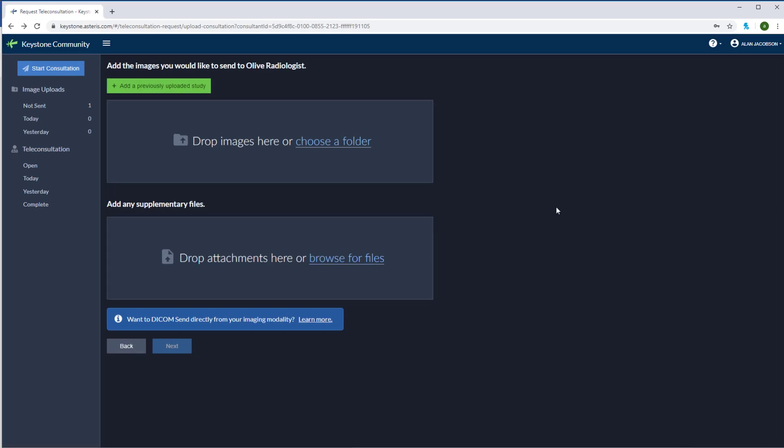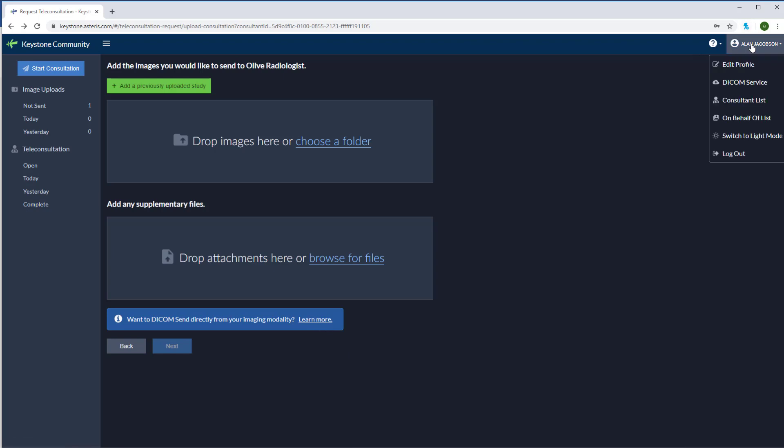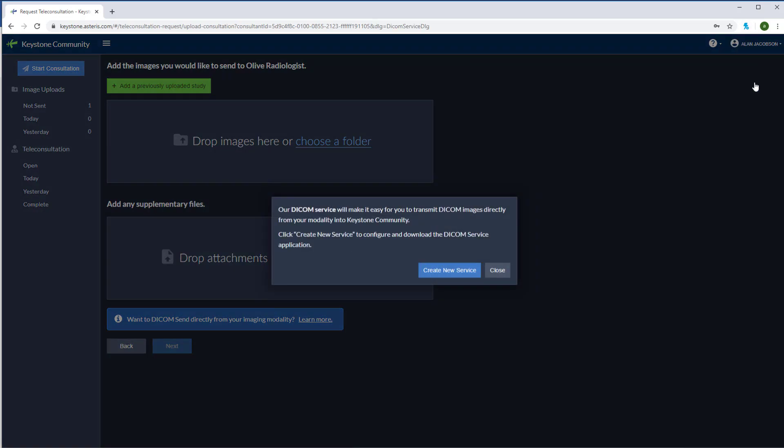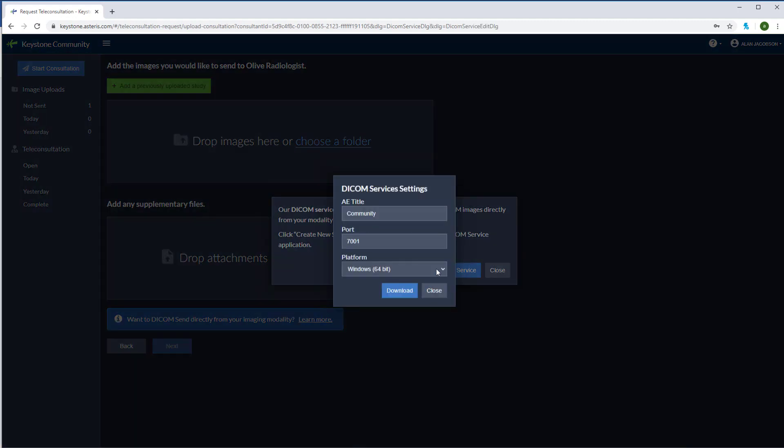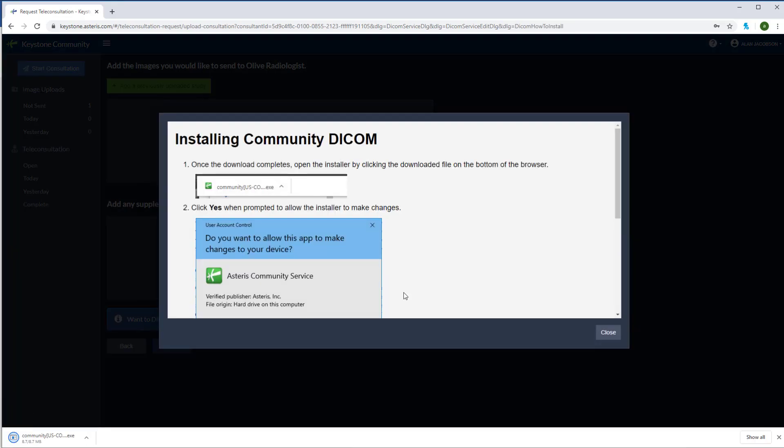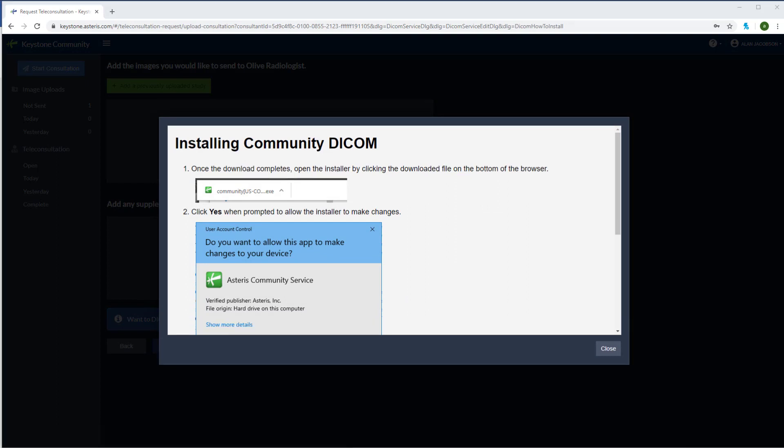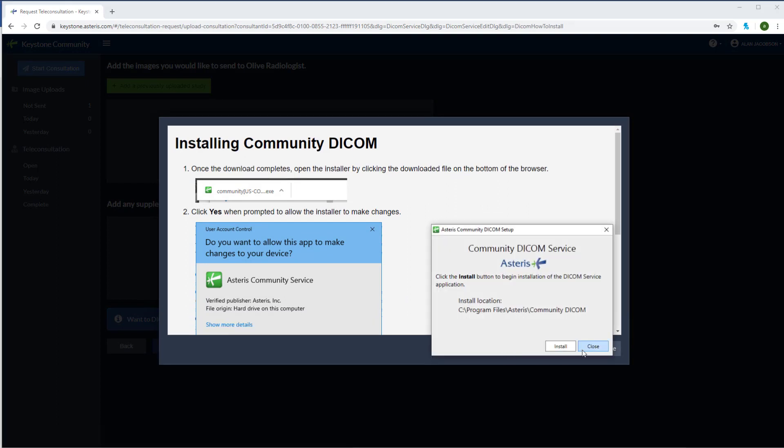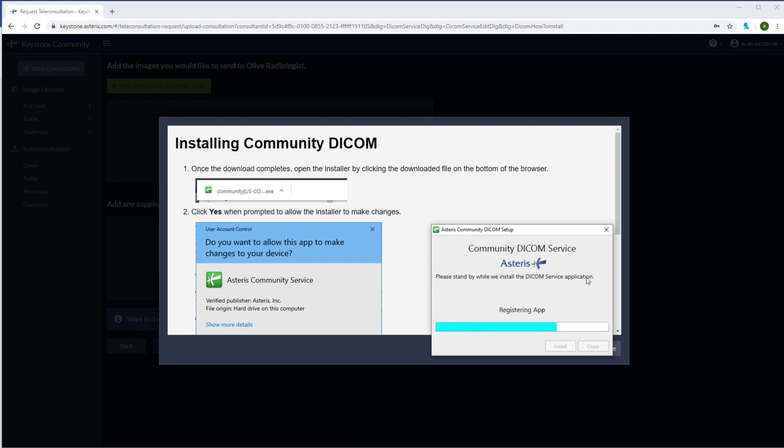We do offer a free DICOM service. If you'd like to configure your modalities to communicate directly to Keystone Community, click learn more here or go to the top right and select DICOM service. Here you can create your DICOM service. Just make sure to select Windows or Mac. Now I'm going to download the service. We'll open up the installer, click install, and within moments you'll have a usable DICOM service for image uploads straight from your modality to Keystone Community.